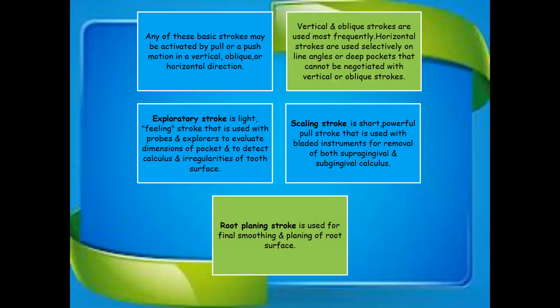All of these basic strokes may be activated by pull or push motion in a vertical, oblique or horizontal direction. Vertical and oblique strokes are used most frequently. Horizontal strokes are used selectively on line angles and deep pockets that cannot be negotiated with vertical or oblique strokes.